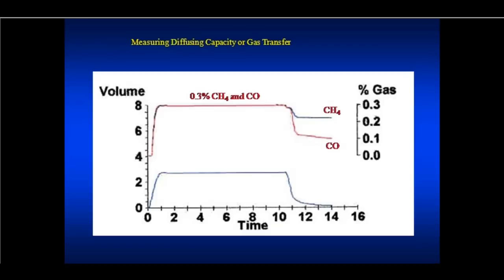Well, the thing is that the driving pressure, the gradient for oxygen is so tiny, the equipment to do this and the conditions need to be so precise and sophisticated that it's impossible to do in the clinical setting. Carbon monoxide is much easier to measure. Driving pressure is much greater, a little bit more room for error and still get good information. So that's why we do this.